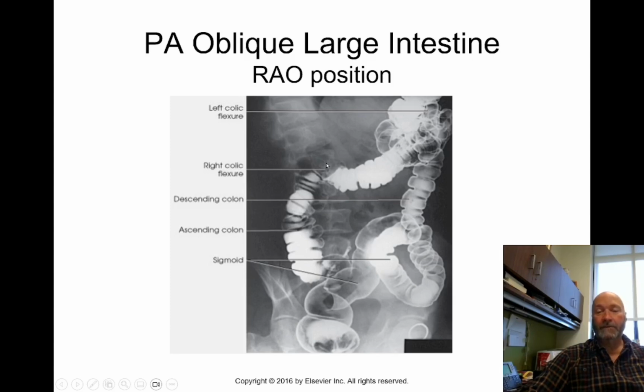Keep in mind that your transverse colon is also anterior, so this is coming back posterior just a little bit, so the difference in the angulation at that flexure could account for what we're seeing here and why the hepatic flexure is not full.